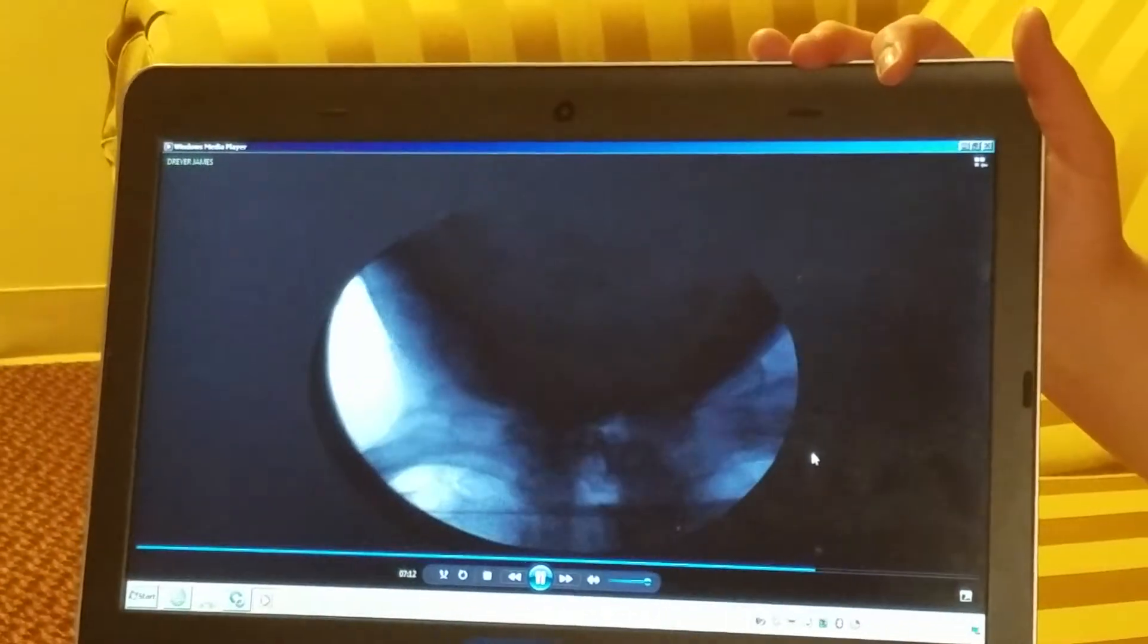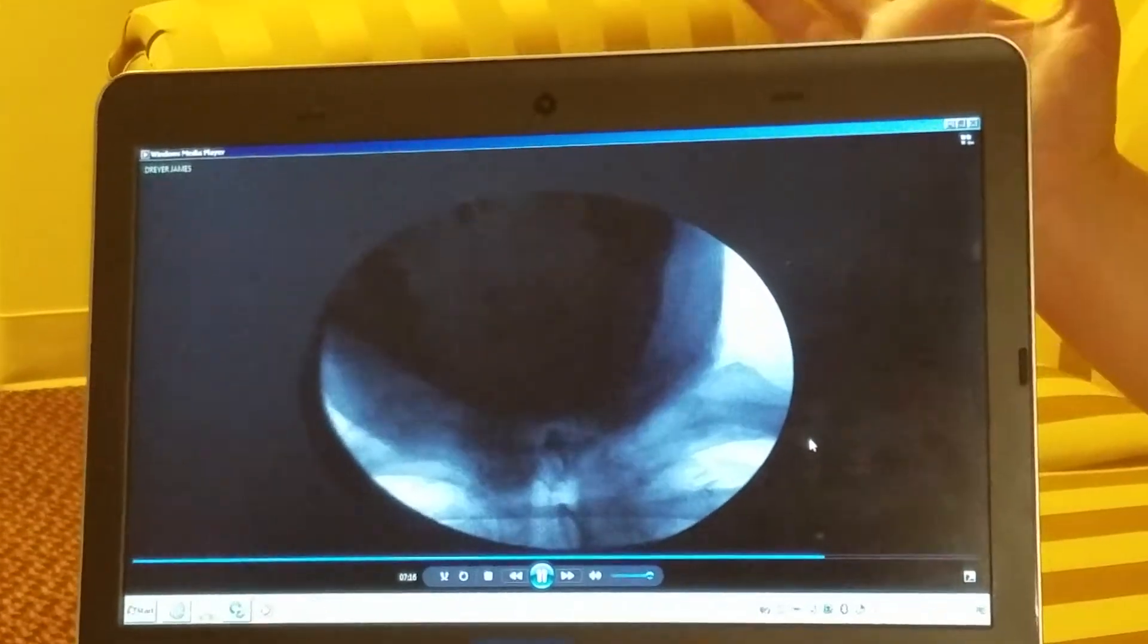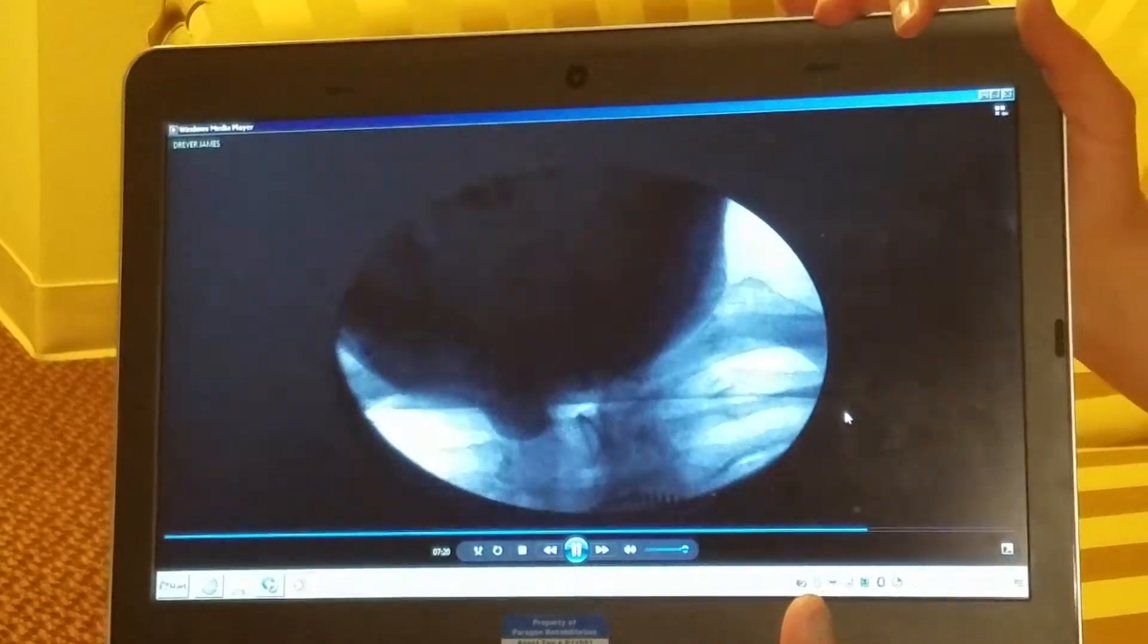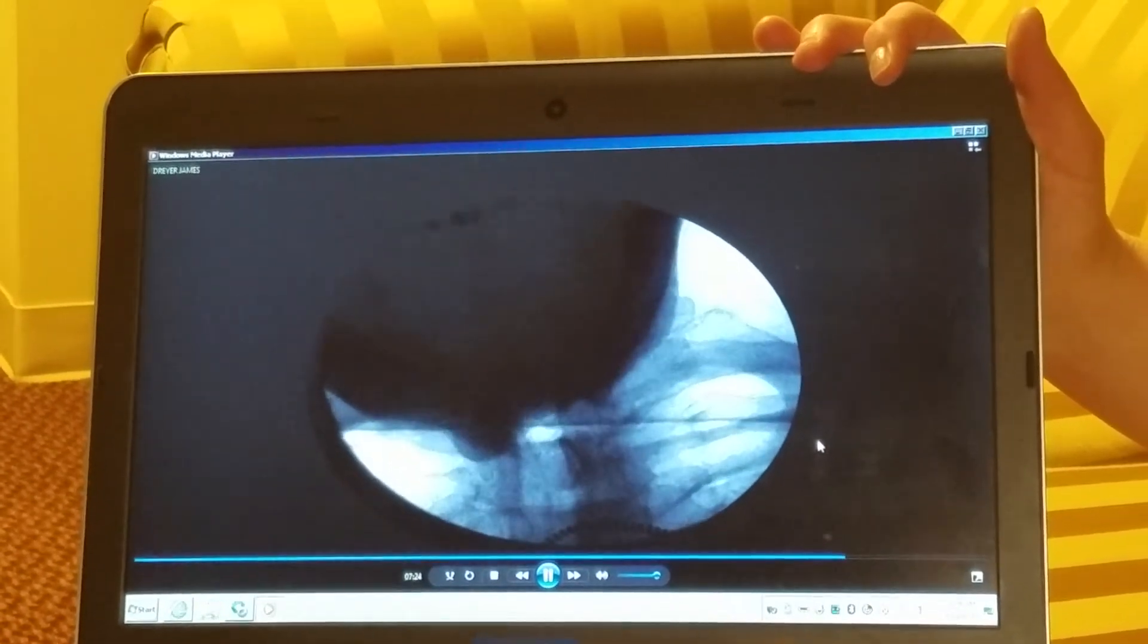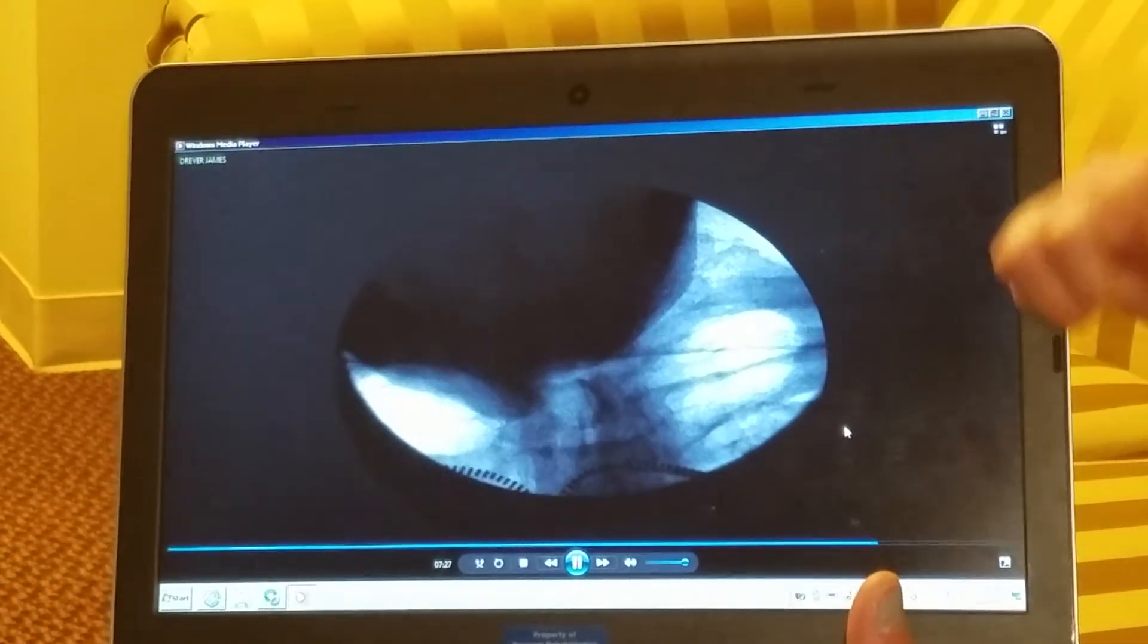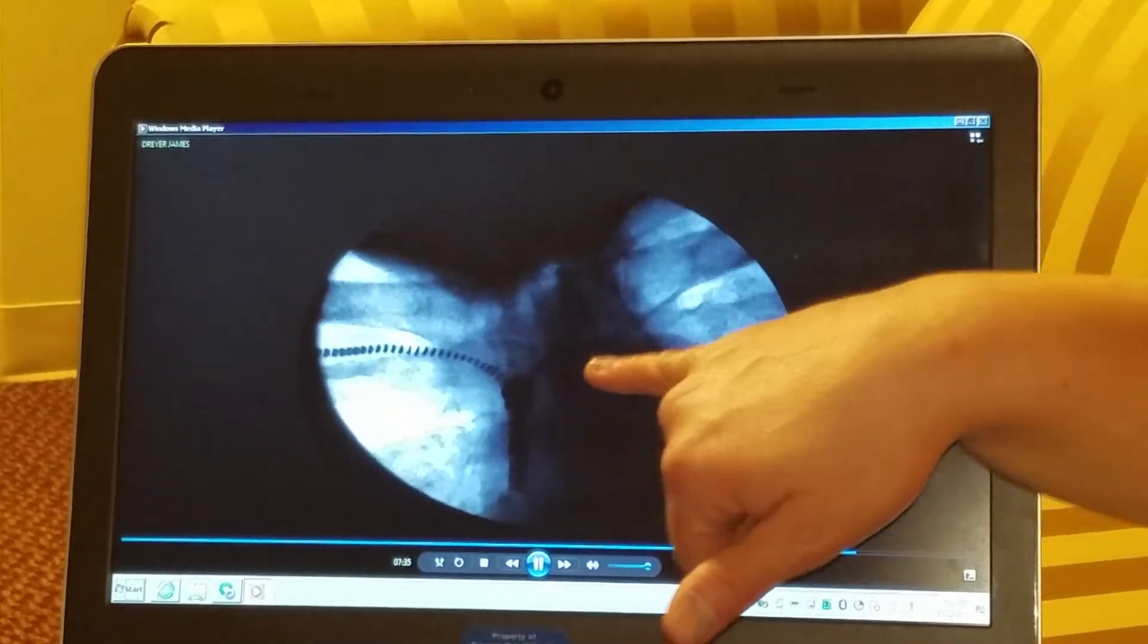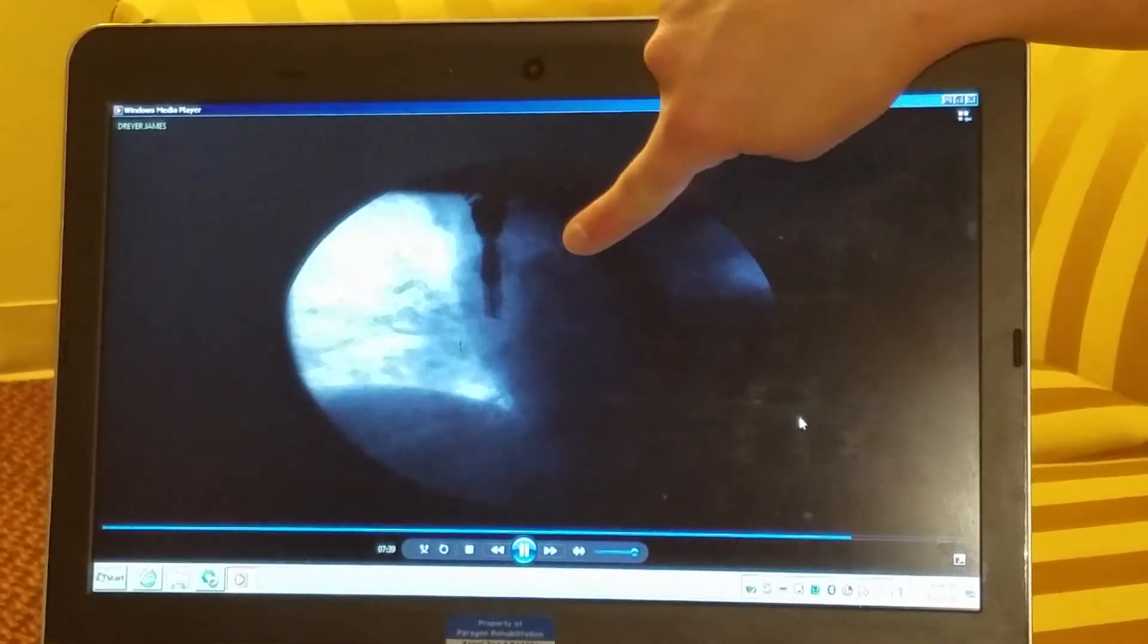She would keep turning the X-ray machine on and off, so that's why it goes blank. We reduce the radiation exposure. Which I used to do these when I was pregnant, and so far all my kids are fine.